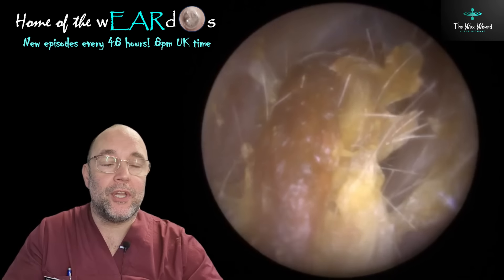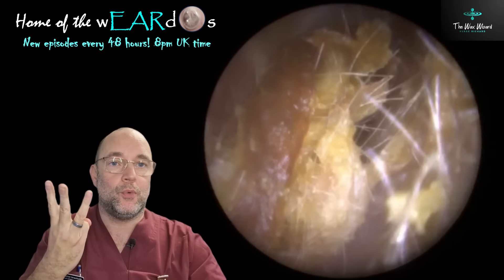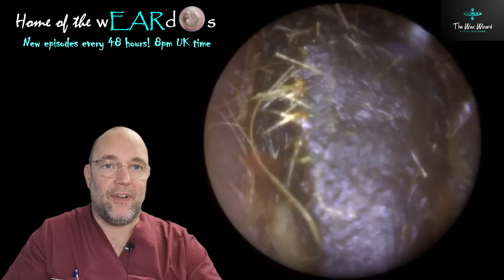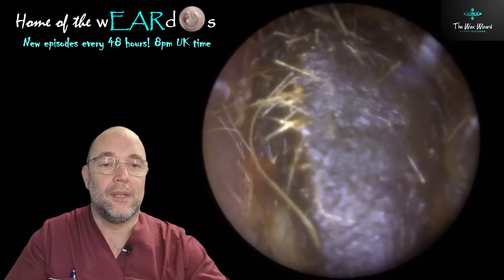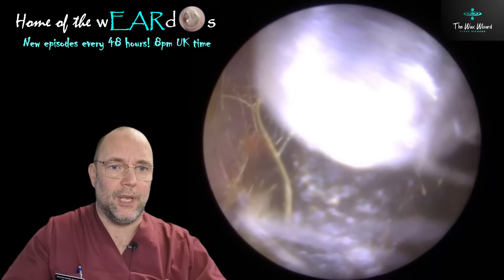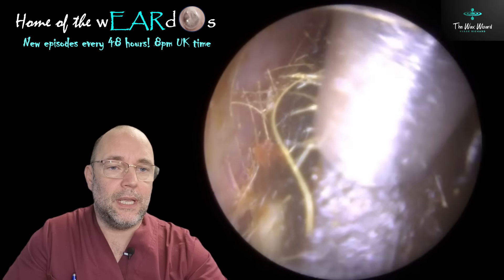Hello, good afternoon, good evening, good morning and welcome — it's Nurse Richard, the Wax Wizard. Thanks for joining me for episode 231. This was a right faff, this one. There's a new tool coming out in this one as well, whether it works very well or not I'm not entirely sure — I'll let you be the judge of that. This patient came to see me and it doesn't look like much, does it.